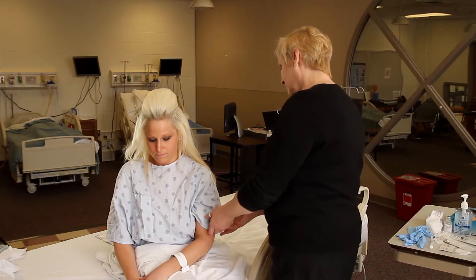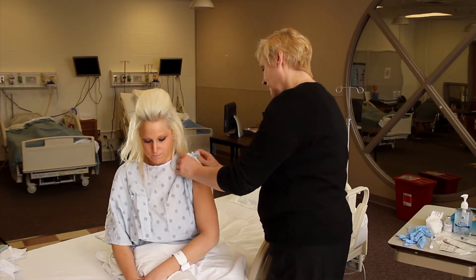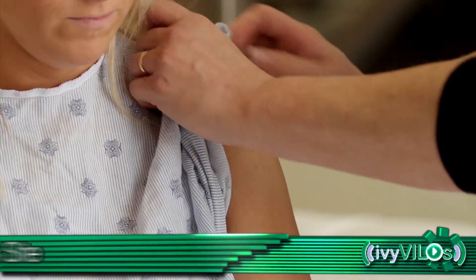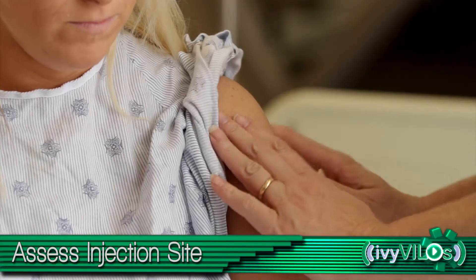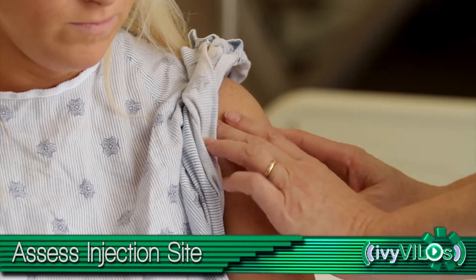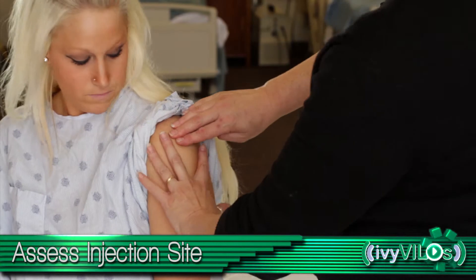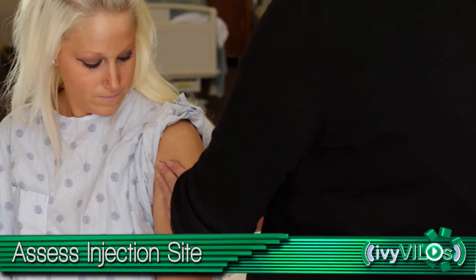Provide privacy. Complete necessary assessments of the site, observing for areas of bruising, tenderness, hardness, swelling, inflammation, or scarring.